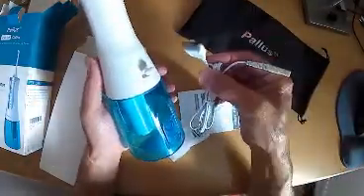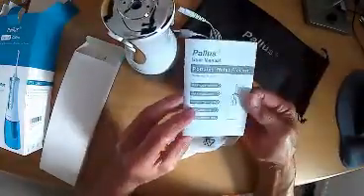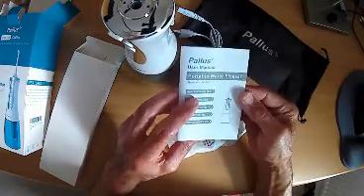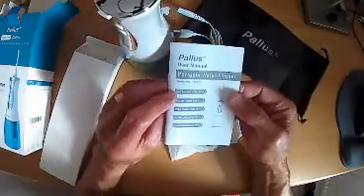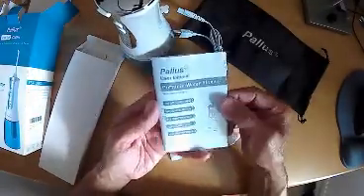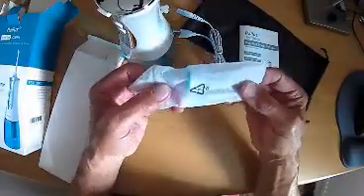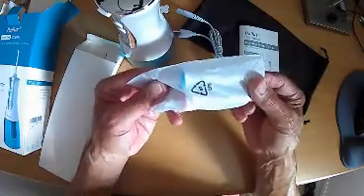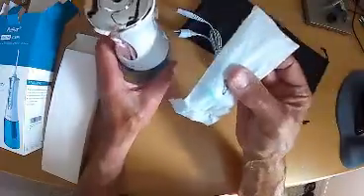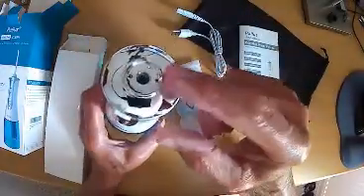You get the USB cable and comprehensive instructions in a number of languages, but importantly for us in the UK, in English. As you can see on the manual it refers to it as a portable water flosser. There are two jet nozzles in a sealed packet with colour coding — one blue and one red — so that two different people could use the device, simply inserting the corresponding jet nozzle into the top of the unit.